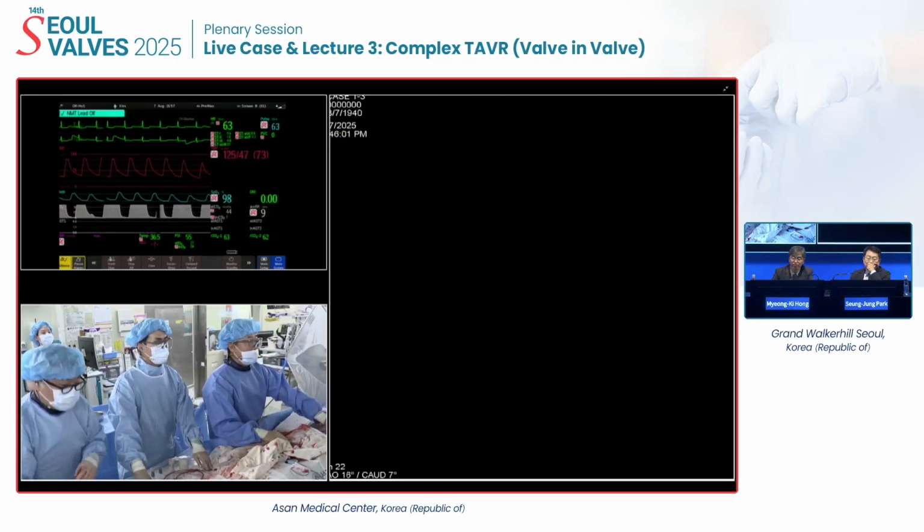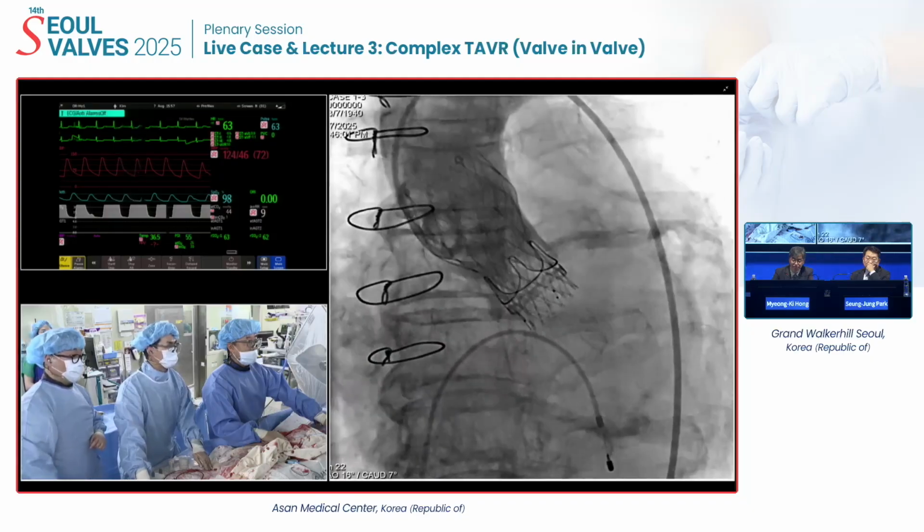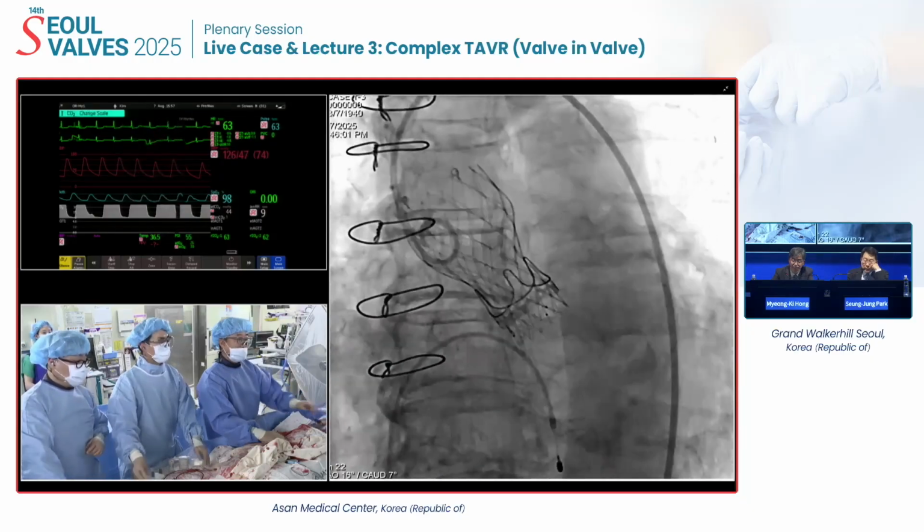Go. Okay, pulse shot. It's good. Yes, there is no AR.